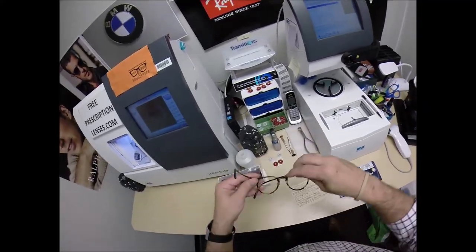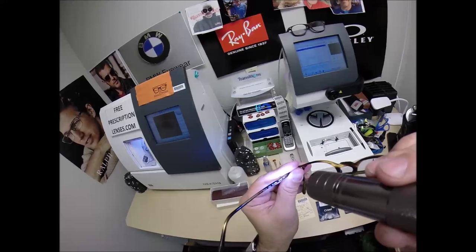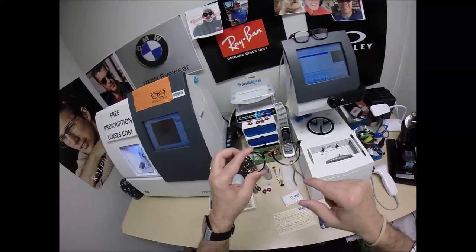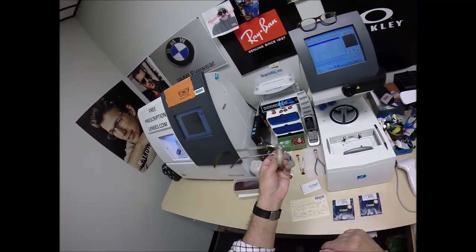This is the 5183, the O'Malley in color 1003, and the 47 eye size — not 57, the 47 eye size. Great classic styling. It has the keyhole bridge. These are made in Italy. Oliver Peoples' great, great collection. So let me begin.